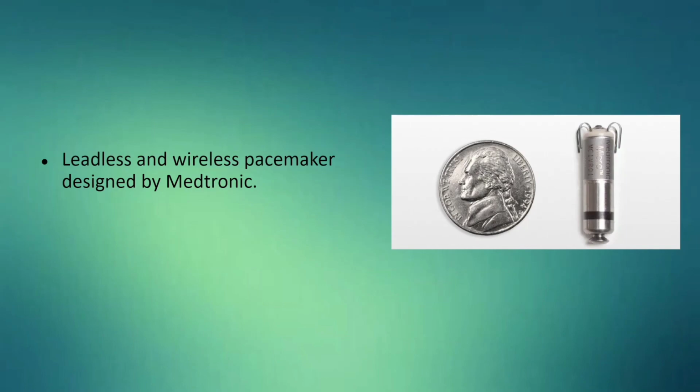However, pacing therapy is typically delivered to multiple chambers of the heart in a synchronized manner, and the bulky size and shape of the new leadless pacemakers don't allow for multiple chamber pacing, but it can still be considered the best development of recent times. There are a lot of studies ongoing that have not been concluded. We hope that these studies will have positive results in the fastest way and provide people a more comfortable and quality life.